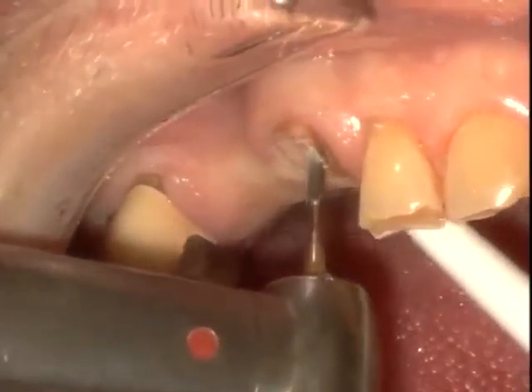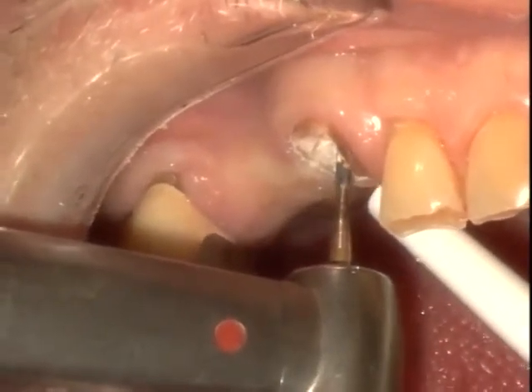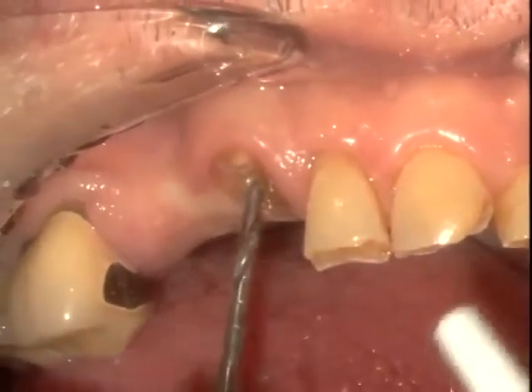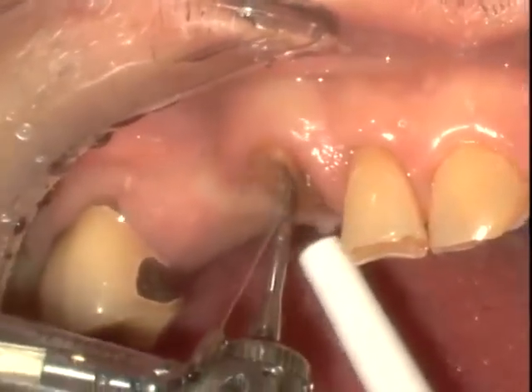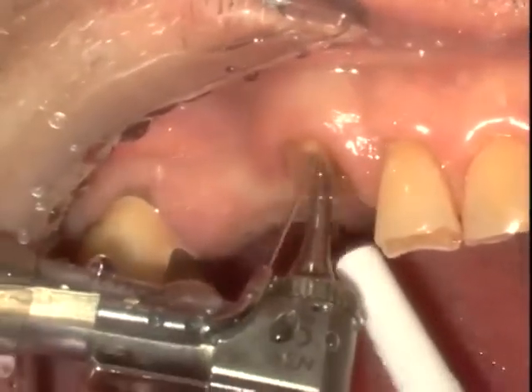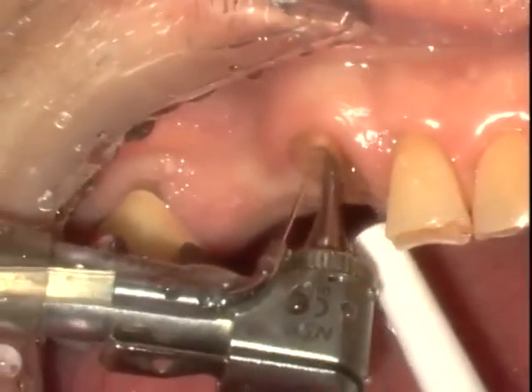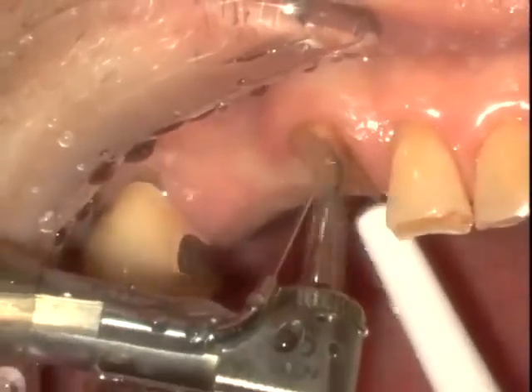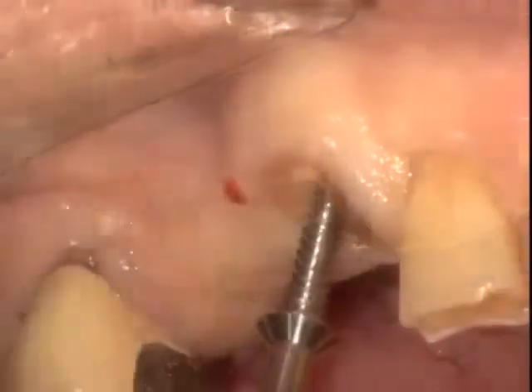Now, in accordance with advanced technologies, what we like to do is extract the teeth with minimal trauma. And what we're doing here is accessing the root canal space of the canine in order to facilitate an atraumatic extraction technique utilizing the Easy Extract system from A-Titan Incorporated. We are going to access the canal very much like a parapost, and we go down to a preliminary depth that you can see by the digital markings on the side of the drill.